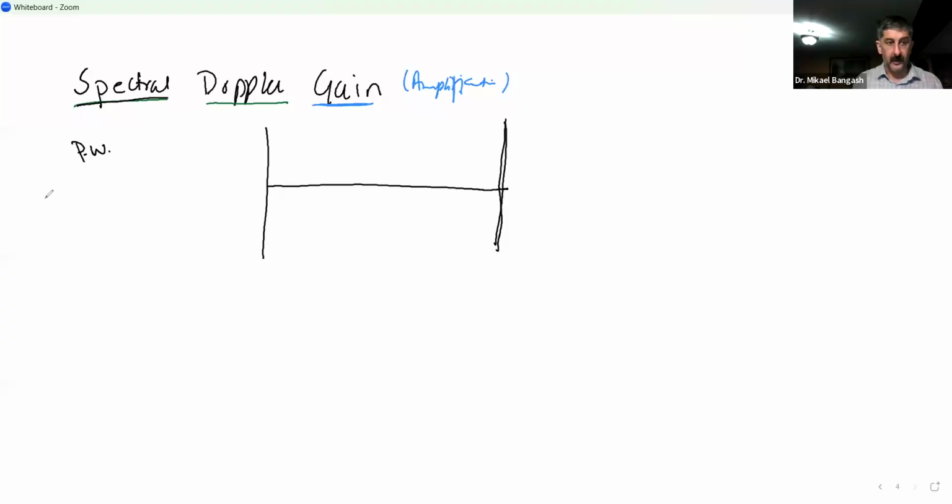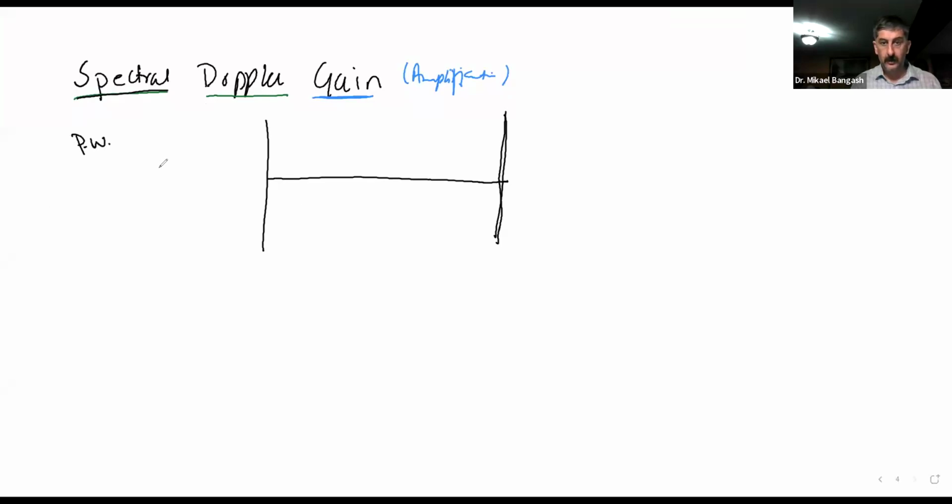You will still have your regular B mode image. What happens on your B mode image is not going to be controlled on your pulse wave Doppler. If you want to make any adjustments to the image here, you have to go on to your B mode slot.